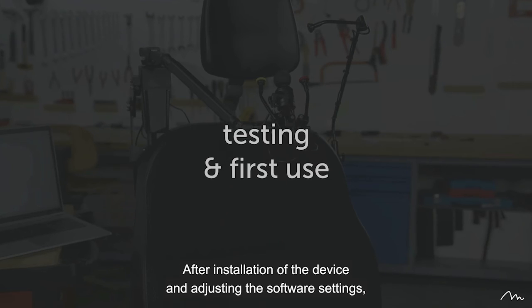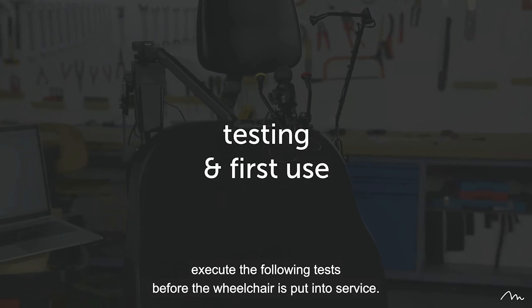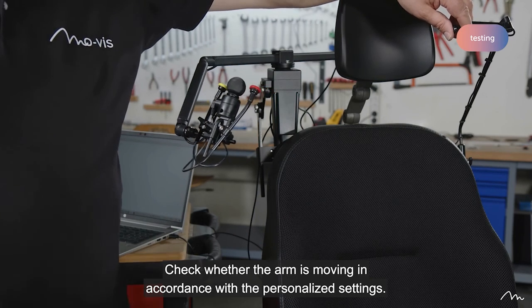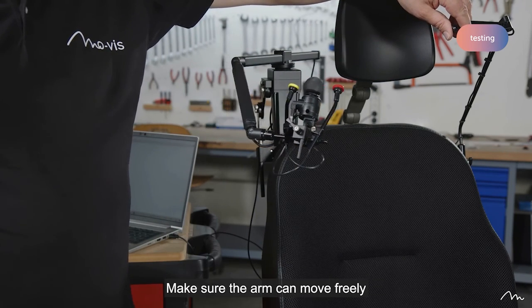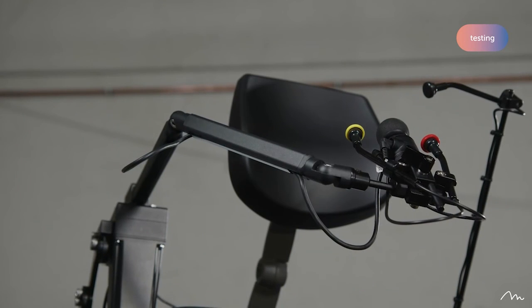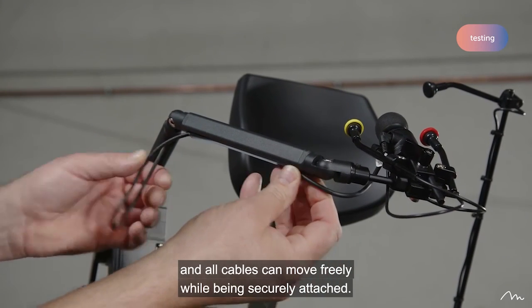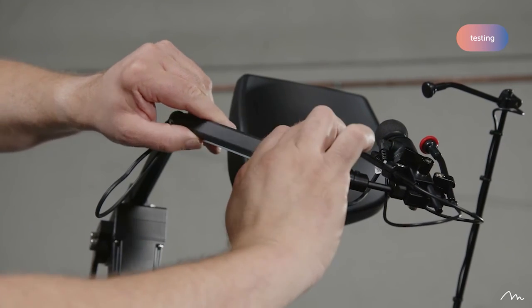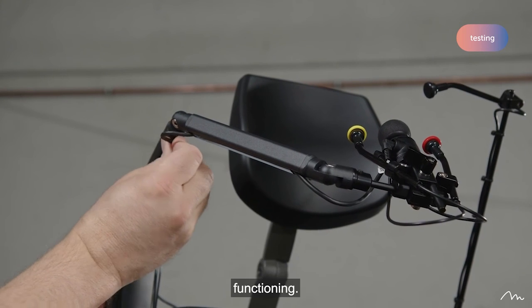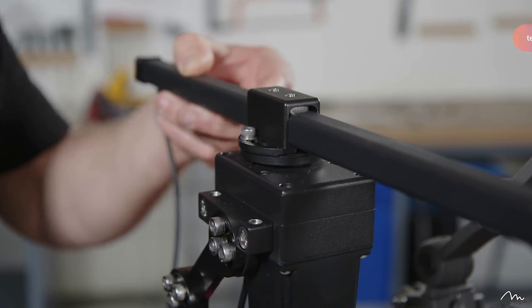After installation of the device and adjusting the software settings, execute the following tests before the wheelchair is put into service. Check whether the arm is moving in accordance with the personalized settings. Make sure the arm can move freely without hindering any wheelchair item or cable. Also make sure the arm can move without hindering a person in the wheelchair and all cables can move freely while being securely attached. If necessary, adjust the positioning of the arm and device and secure functioning. Check if all screws are tightened firmly.